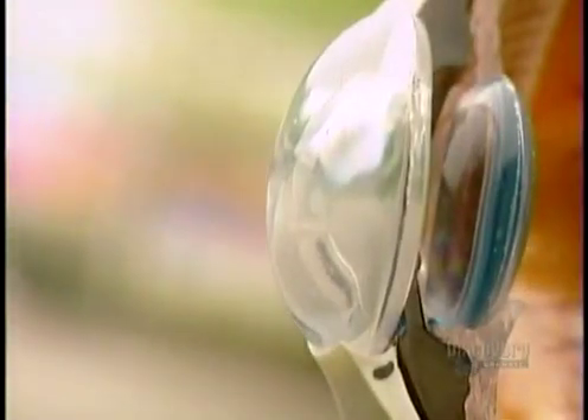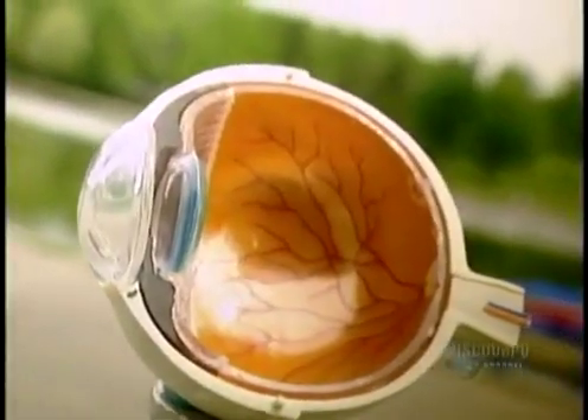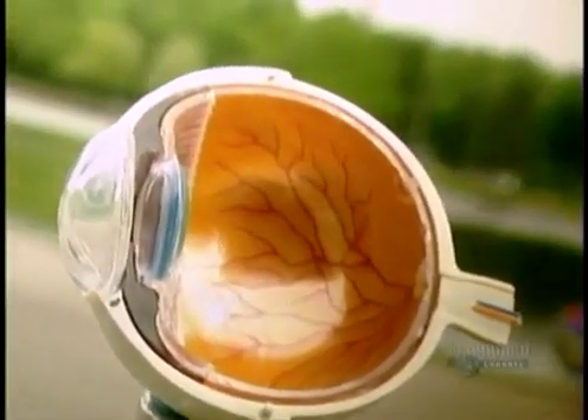Short-sightedness, far-sightedness and astigmatism are all due to light not focusing precisely onto the retina. Surgeons can correct this by using a laser to reshape the curvature of the front surface of the eye, called the cornea.